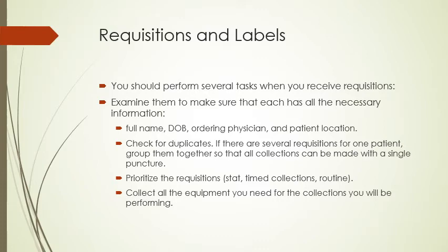Make sure we're prioritizing the requisitions or labels, meaning that if something says stat, it means immediately. That needs to be done immediately, needs to be run immediately. Some are timed collections, where it's a specific time that it needs to be drawn. Others are routine, where it doesn't matter as much as far as prioritizing. Before you start, obviously you want to make sure you collect all the equipment you need for the collection that you will be performing.